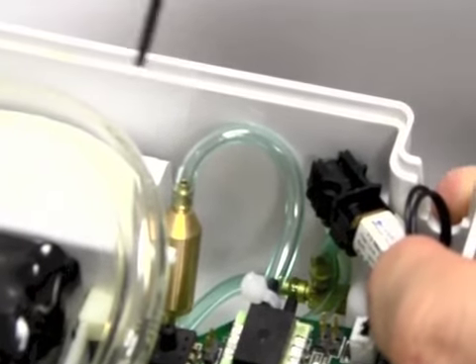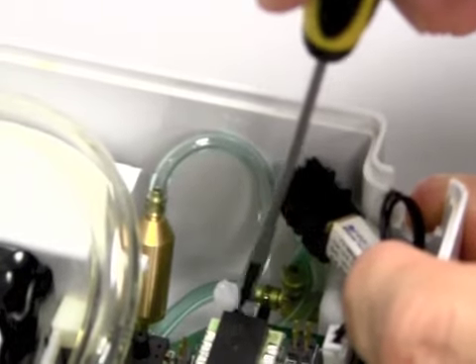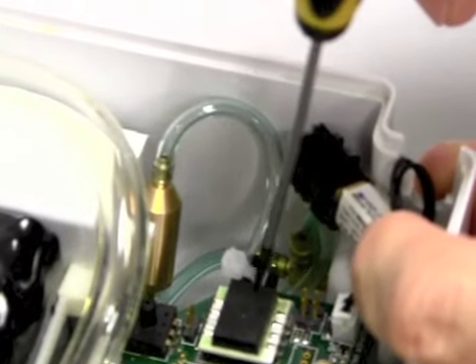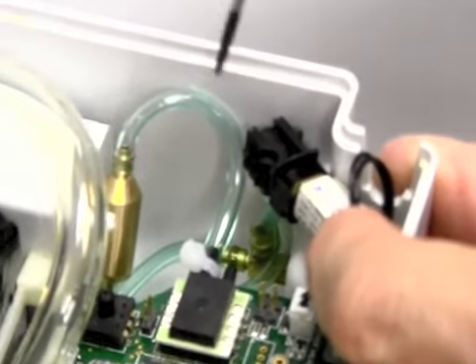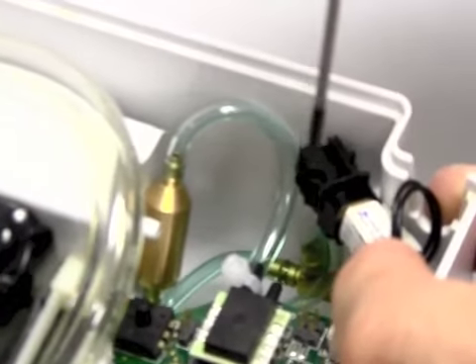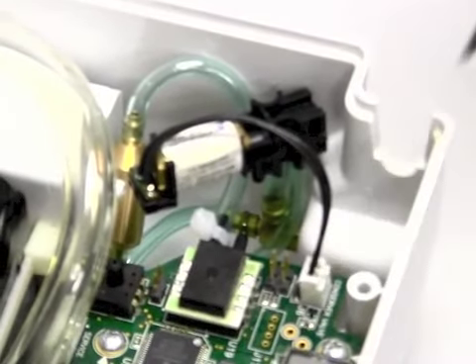This now shows that the isolation valve is completely installed. Again, note that the cone and the tubing going to the pressure sensor on the board, the cone is pointing at the pressure sensor. Also note the way the isolation valve is laying there. Be careful not to crimp the tubing when you put it in place. And then you'll notice that the two-way valve that I pulled aside, when you're done, will swing back in this direction. And also notice that I have reconnected the valve onto the board.